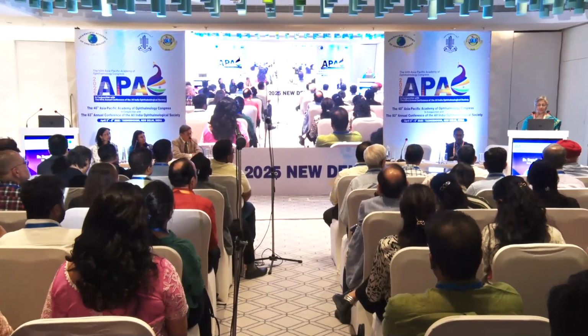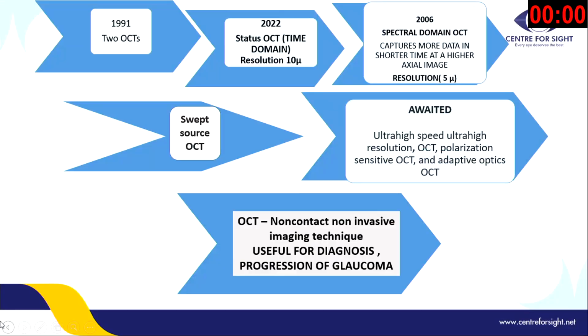And I'll go straight into what is the role of OCT in glaucoma. We all know that glaucoma has come a long way. Just think about it, 1991.